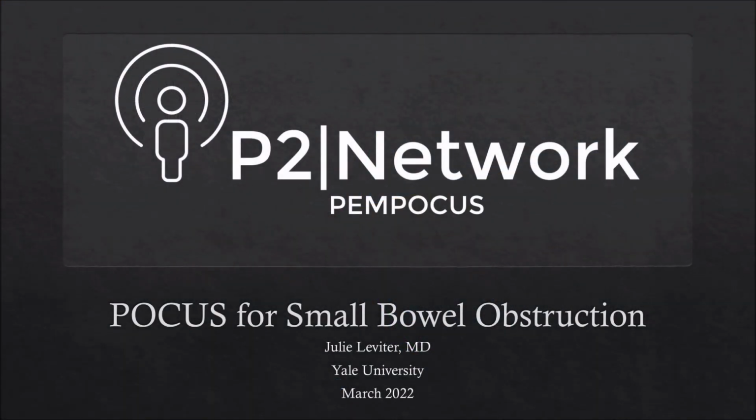Hi, my name is Julie Leviter. I'm at Yale University. We're going to be talking today about point-of-care ultrasound for small bowel obstruction.